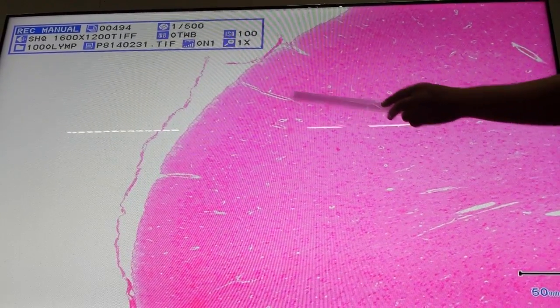layers of the cerebrum. Here we have the gray matter, and then the middle portion would be the white matter. The meninge that we would identify here would be the pia, the innermost meninge. And then in the gray matter, the outermost layer, we have the molecular.